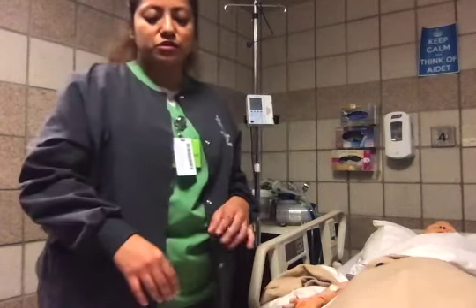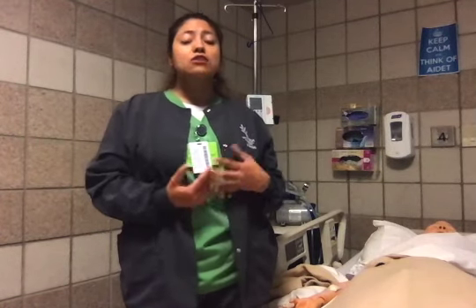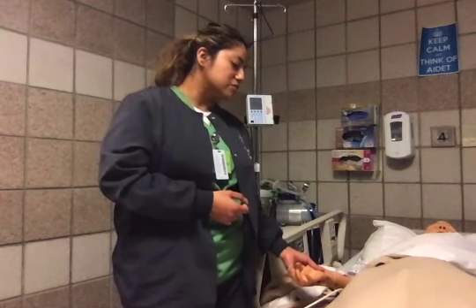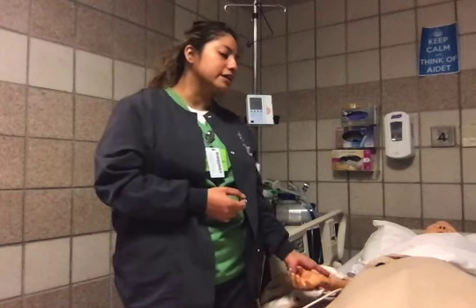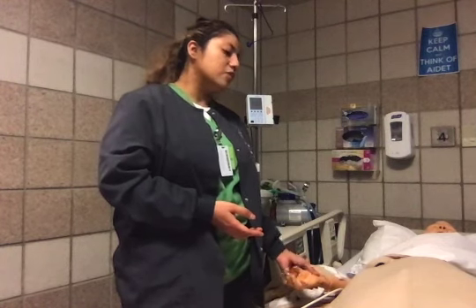Before I put my medication in, I'm going to be looking at my patient's MAR and looking at his allergies. This medication is contraindicated for people who are allergic to penicillins, cephalosporins, beta-lactams, and tazobactams. If he's allergic to any of those, or if he has had any reactions in the past, then I will not give the medication. Also at the bedside, I will ask my patient for any allergies. Do you have any allergies, Mr. Ivy? Have you had any allergic reactions to any other medications, or do you have any sensitivities? No? Okay. All right, then I'm good on that area.